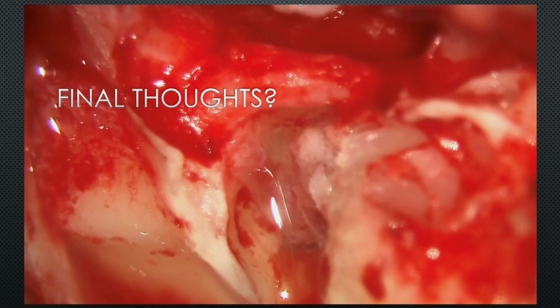Thanks, Tom. Juan Kiosana from Miami. I'm curious about that case where you have the epidermoid, which is right in the hypotympanum. I have used endoscopes for benign lesions of the hypotympanum. And Walter is here, you are very experienced endoscopically. Would you consider making the approach and being able to convert to a proper endoscopic removal? What it means is that you put the endoscope in safely and try to do a surgery that can preserve the labyrinth.